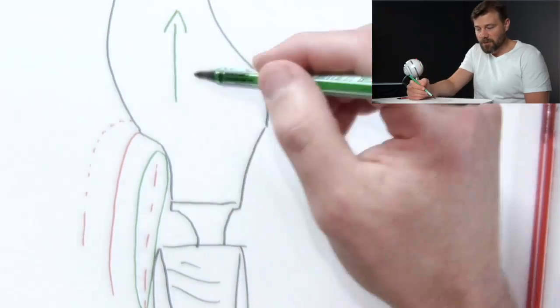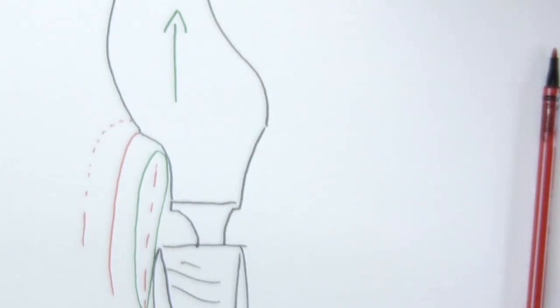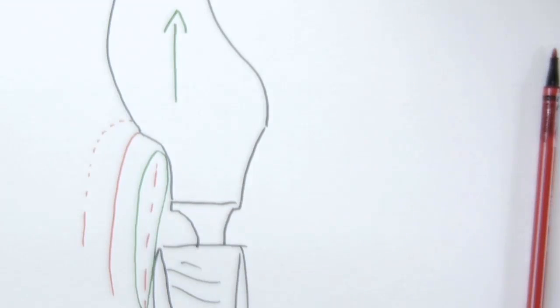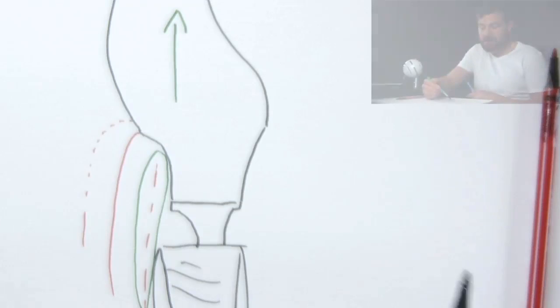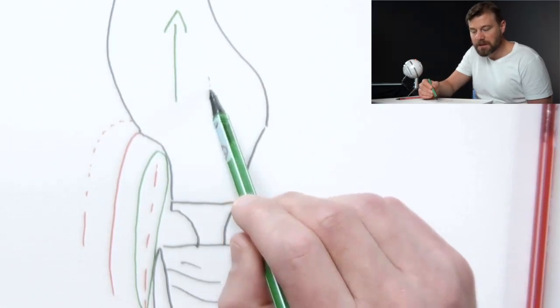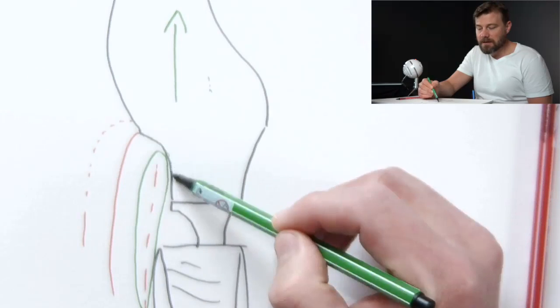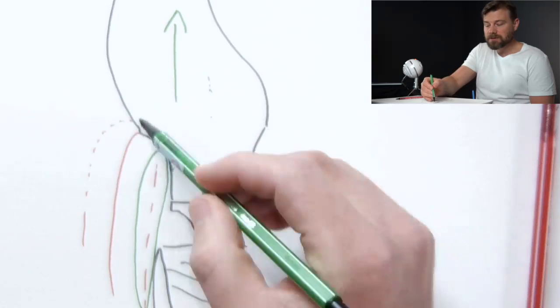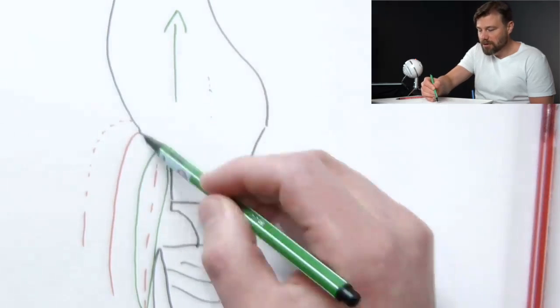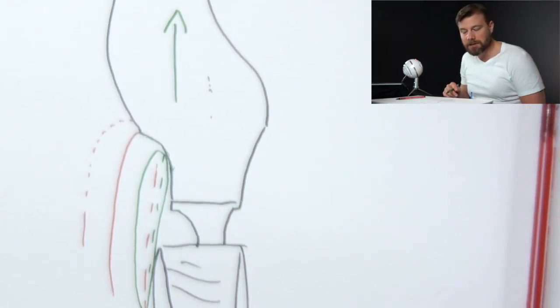If you can remove the crown, this work here is going to be very easy, and you can do that with a lot of safety to prepare this tissue. But if you cannot remove this crown, this difference in the contour of the crown is going to make it very difficult for you to turn the blade, your tunneling instruments, to prepare exactly this tissue in the right place.